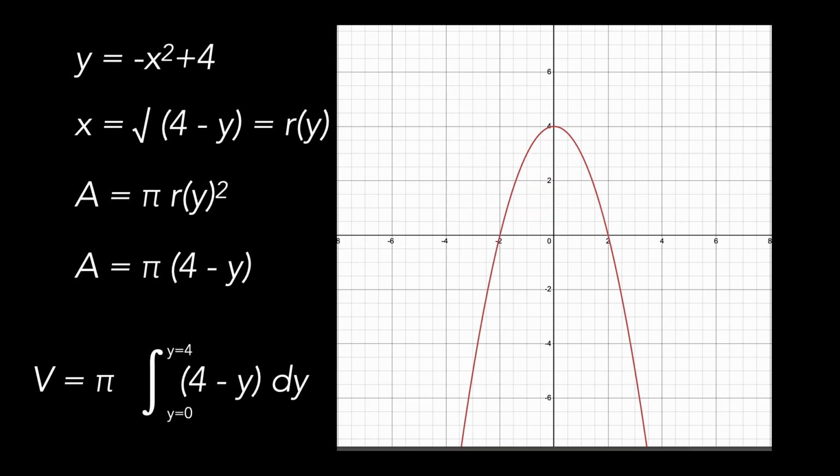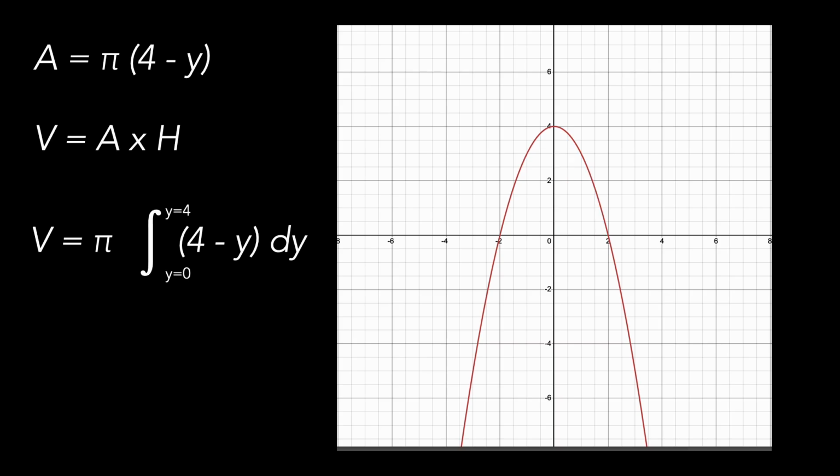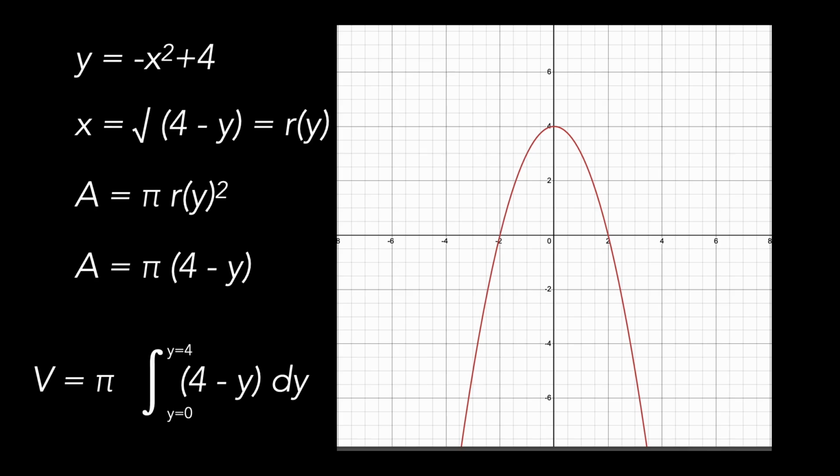And so to do that, we essentially say our volume is, or we can get the area here, and our volume is equal to, let's go to this slide right here, our volume is equal to our area times our height, right? Just a simple geometric equation. So if I can calculate an area and a height, then I can get essentially the volume. And so going back to this one, essentially in ultrasound, what we're going to do is instead of stacking these columns vertically, we're going to stack them horizontally.